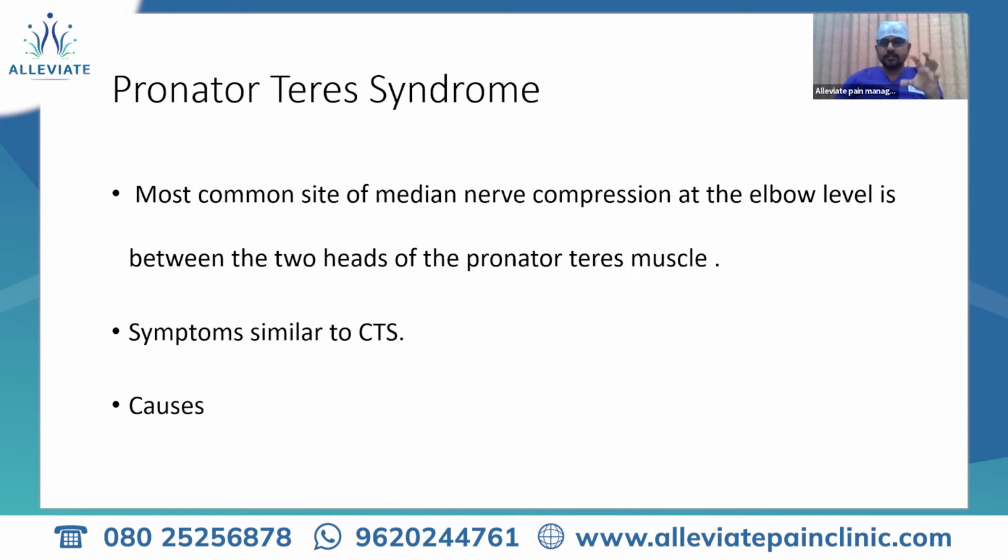So basically, you can evaluate the nerve. When you evaluate the nerve, first and foremost, the normal echogenic appearance has to be understood. You can always compare with the normal side. You have to look for the features of the muscle also involved. What is stated is that there can be an increase in the size of the nerve, or it can be involving the muscles.